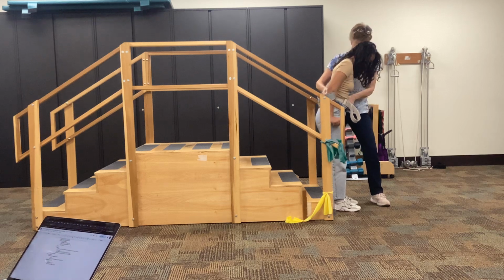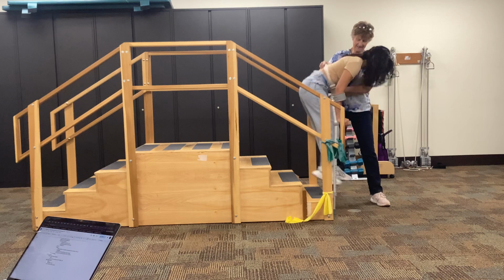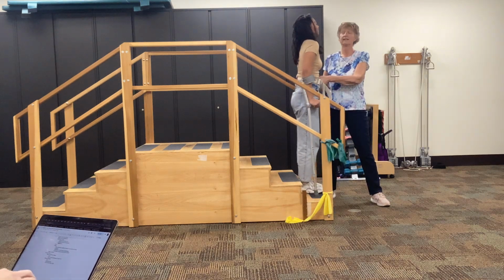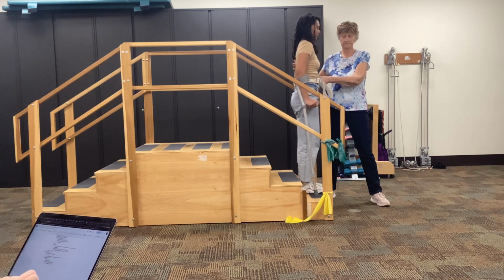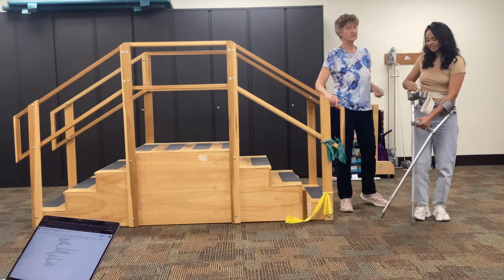All right. Oh, I already bent. Okay. And then crutches up real quick. And then back into that stable C curve. Okay. All right, we're good. It's so hard. It's very hard.